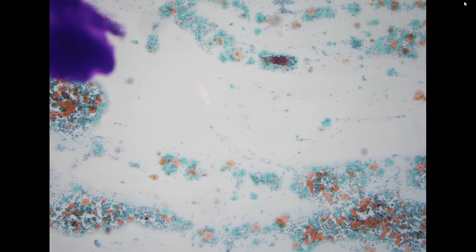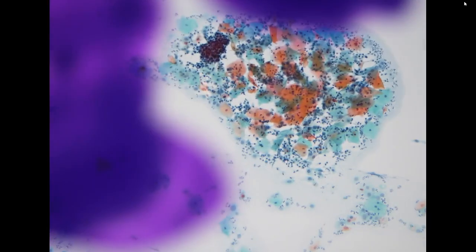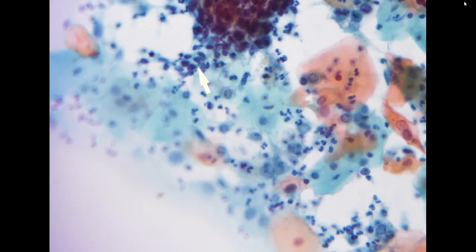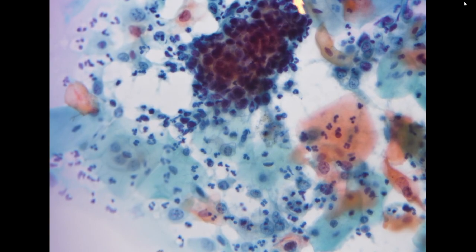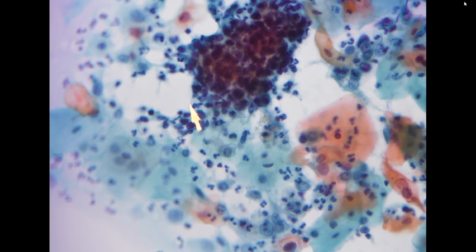I think, first of all, the fixation is not very good, so we have quite some drying artifact. We have a couple of cellular clusters with very prominent hyperchromasia, and it is not easy to see the single cells in the cluster.